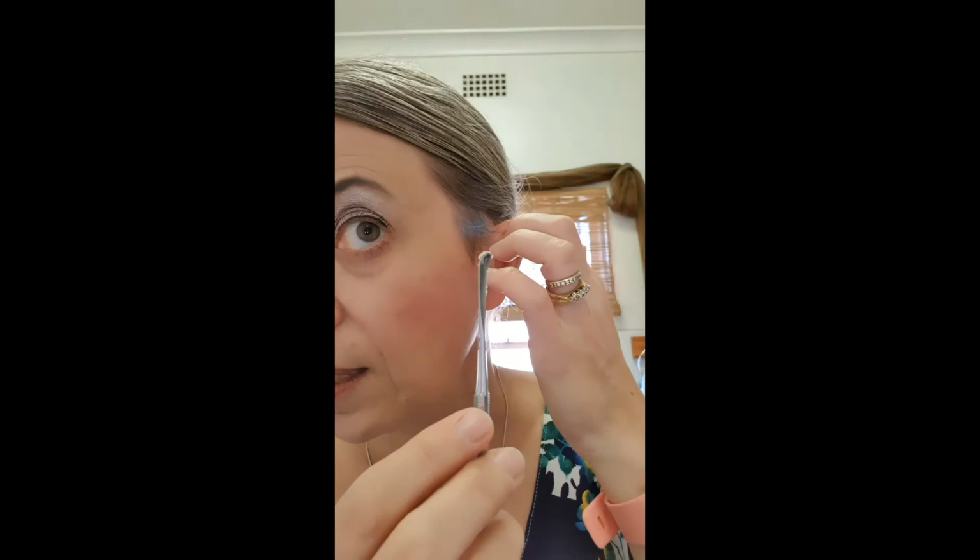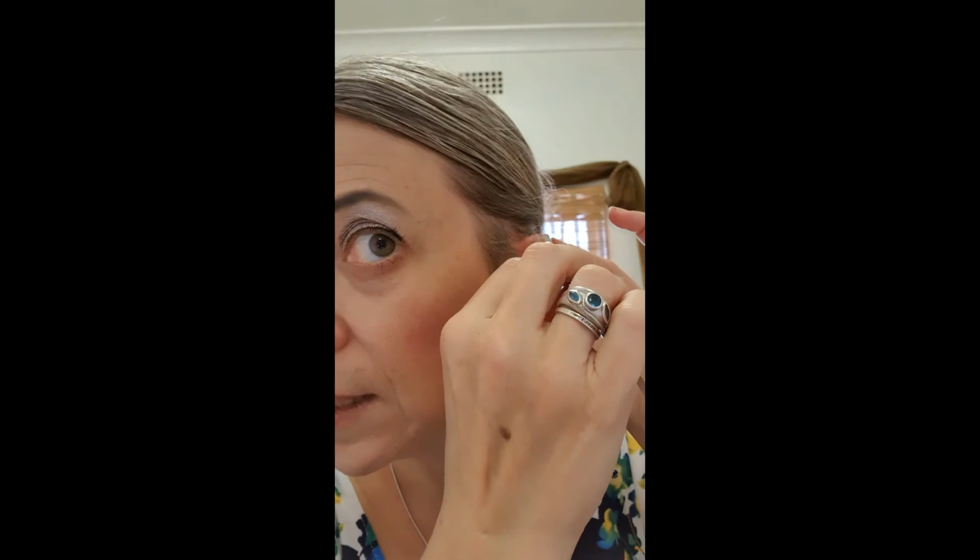Okay, now the other big giveaway is this joint on my ear, and I've had a look earlier, I'm going to turn this around, it looks as if there was hair that got stuck in the prosthesis. So what you're now going to do, turn the thing around, and on that joint we're going to press some wax just to finally smooth it out. You can see that joint is at this stage a bit rough, and it's not a problem. We're going to fix it just now. You can see, okay, there we go.